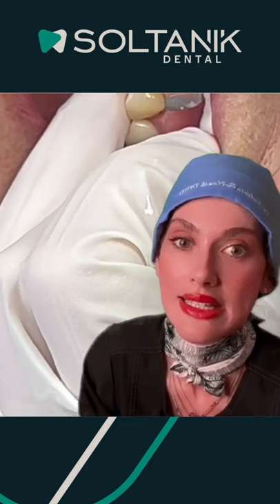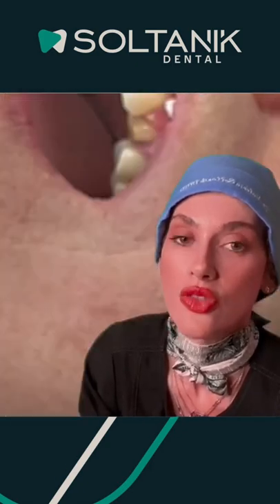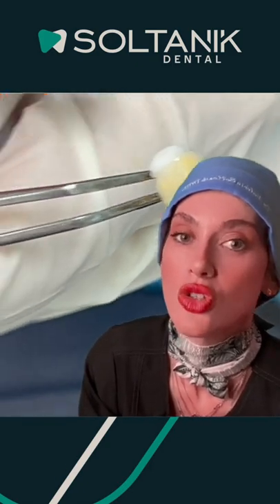So later we put them in the glazing machine, in the oven, for them to be ready to be delivered to the patient. Thank you so much for watching.